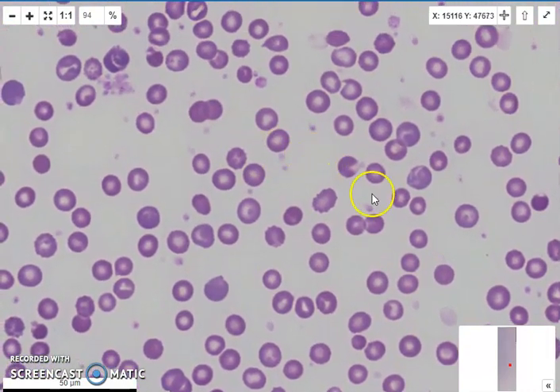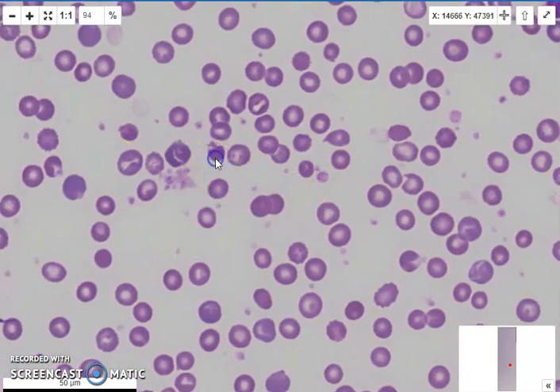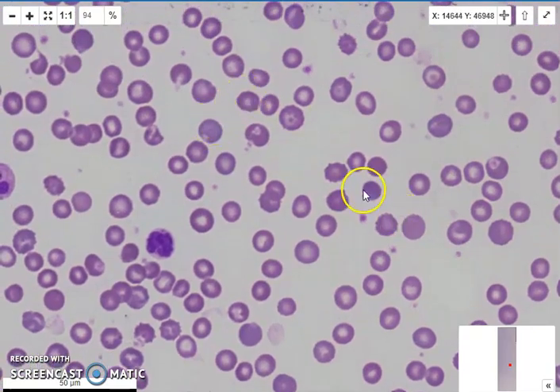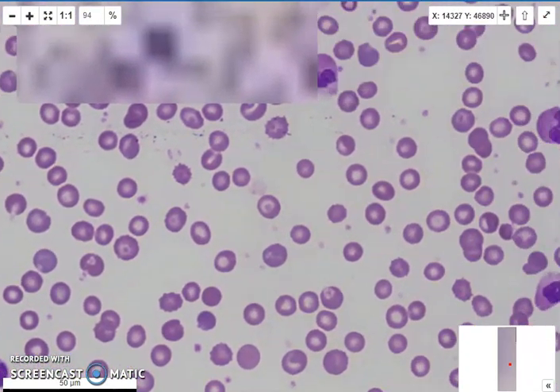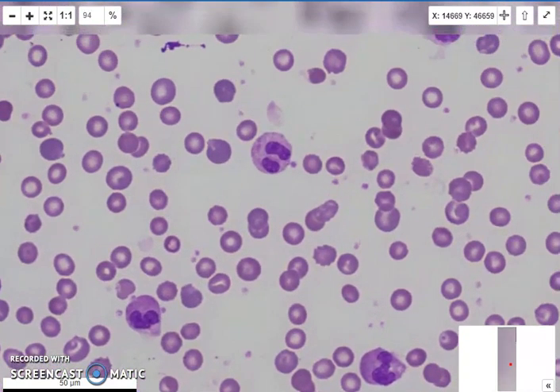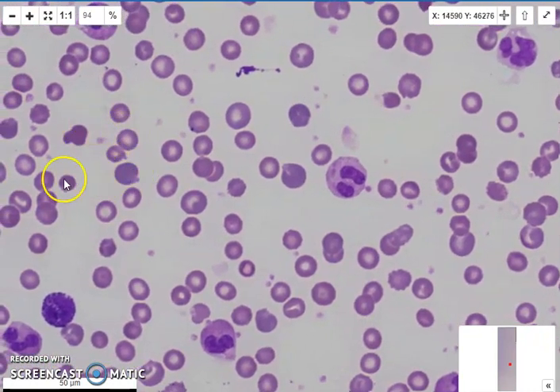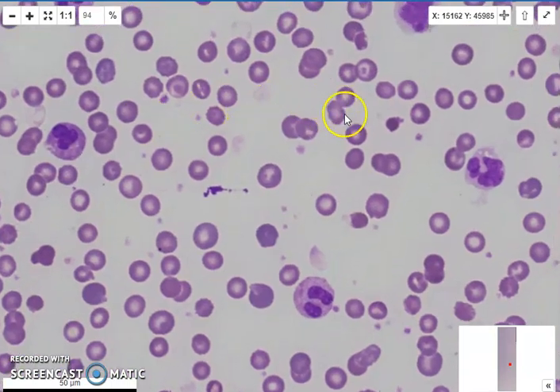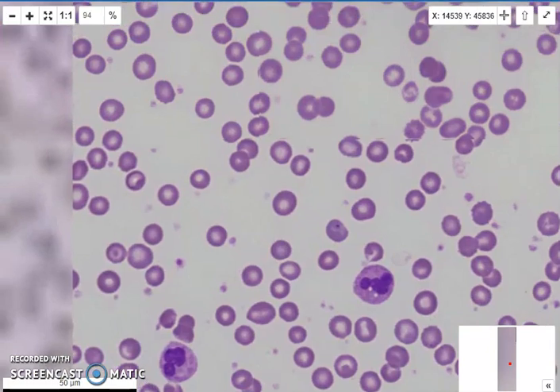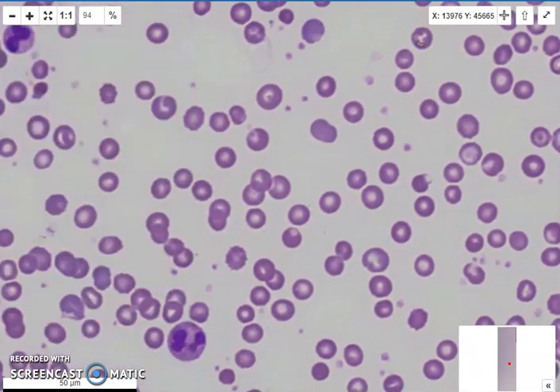So hopefully that will guide you on how to approach cells where you think you have spherocytes, and how to come to the most likely diagnosis for those slides when you see them, and how to be really careful that you're not reporting spherocytes when what you actually have is bite and blister cells, because it's very, very different clinically. This is oxidative hemolysis. You need to remove that oxidizing agent. Usually it's got to do with the fava beans. It's very different to an autoimmune hemolytic anemia, where we're looking at a positive DAT and red cells coated in complement.